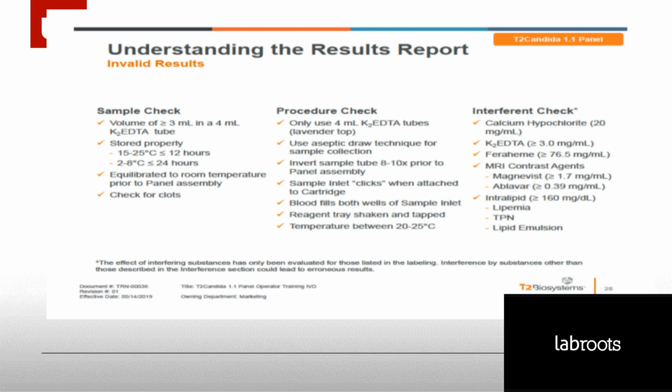As a matter of fact, the bone marrow people have this posted up in their unit to remind their nurses, because they draw all the blood specimens, that is the T2s in this case, and the blood cultures. So once again, the procedure check is very important. That's more pre-analytical as it applies to the laboratory, in addition to the sample check. The far right-hand column here, the interfering substances check, is very, very important for your providers to be aware of. And once again, we reinforce that periodically.